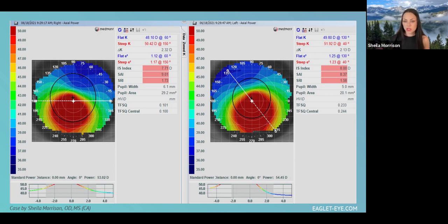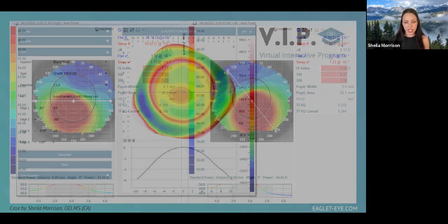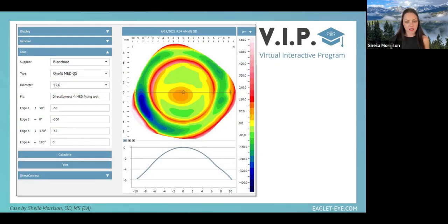Work them up in whatever tools that you have for your scleral lens fitting: corneal topography, pachymetry, ESP, so we'll get a good measure of profilometry. In this case, this patient, this was just last Friday, never had contact lenses before and is interested in getting better vision. I don't show elevation maps, but definitely based on ocular shape, a much better candidate for scleral than any other soft or smaller diameter hard lens. Here's what we do. So I have my technicians work them up, take an ESP, and in the software, there are ways that we can actually predict a starting lens.